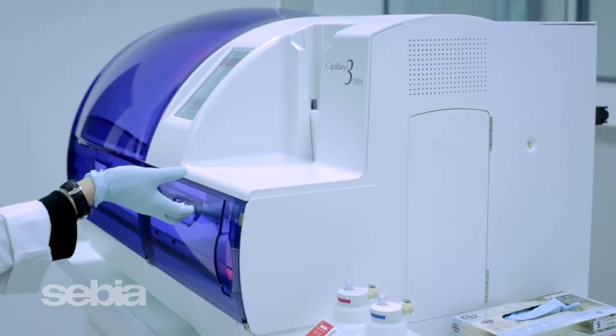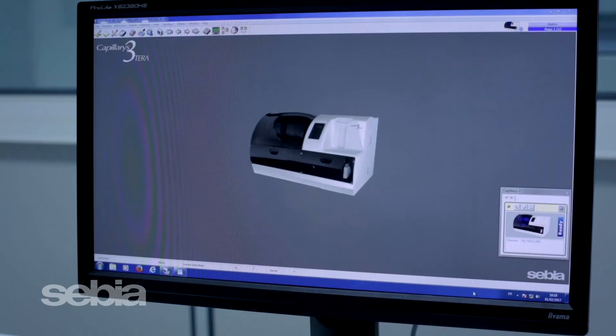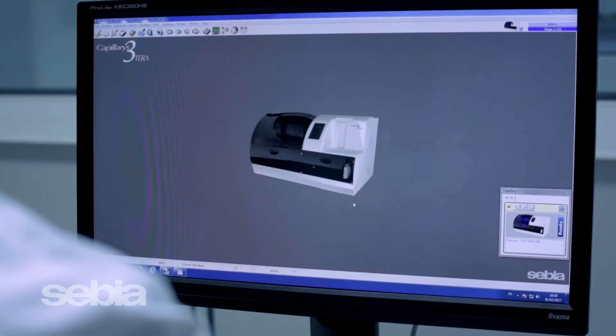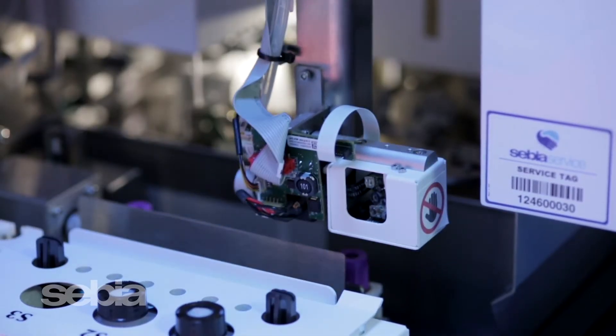Running your QC material is as easy as loading up to two levels on a QC rack and placing the rack onto the instrument. The system will automatically recognize the RFID code on the rack and QC barcode labels and run both controls in each capillary.